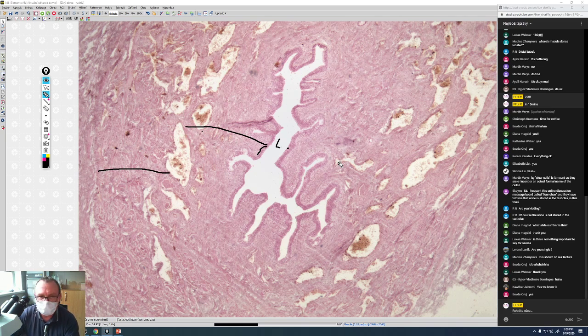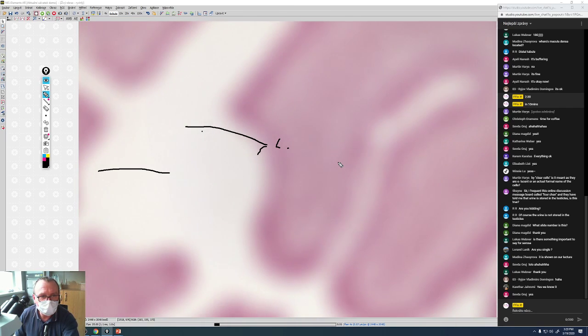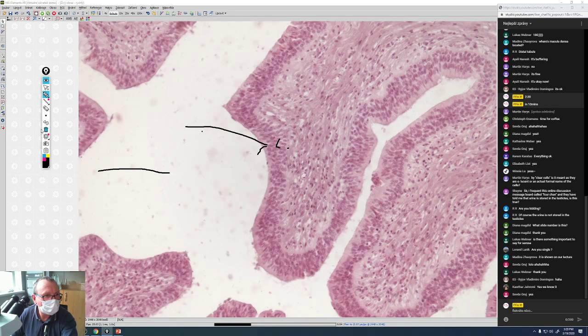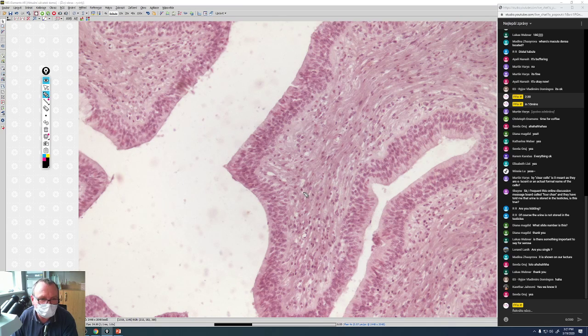Now let's focus on the epithelium. I remove the drawings, and you can see that this epithelium differs from the epithelium of the bladder or ureter or calyx, which you already saw, because it isn't transitional epithelium, but really stratified columnar epithelium, quite a rare epithelium, which is found in some big ducts of salivary glands, for example, and also here in the spongious part of the male urethra.